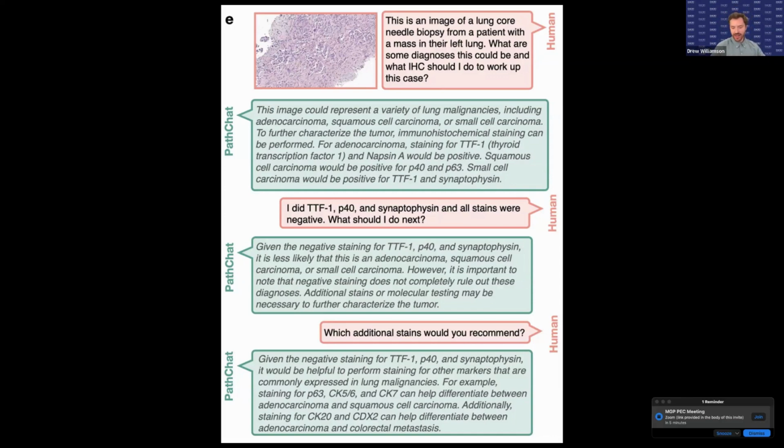in the AI and pathology world, I've heard people talk about this idea of a digital fellow. So when you're in pathology training, a lot of what your job is to get the slides, you write up the report, and you bring the slides and the report to your attending pathologist who looks at the slide, and in my case, crosses out big portions of the report that you've written and writes something entirely different. And then what they've edited goes into the medical record. And I think we all kind of recognize, inside or outside of pathology, that editing a report or text of any kind is much easier than creating it from scratch.